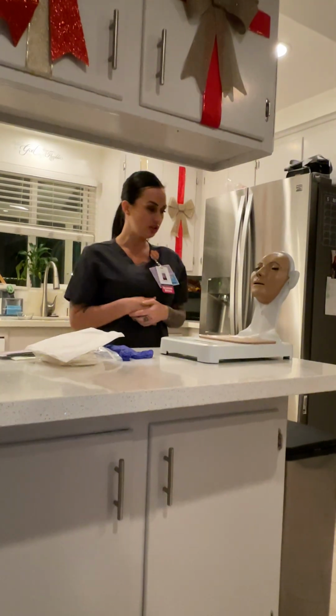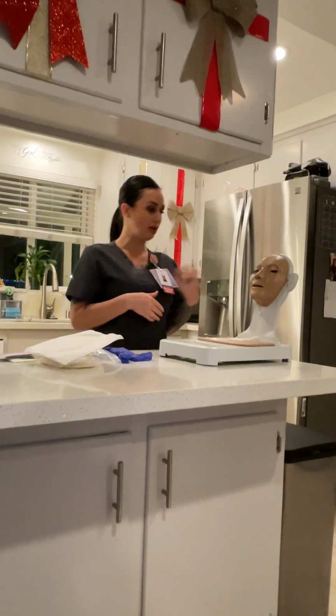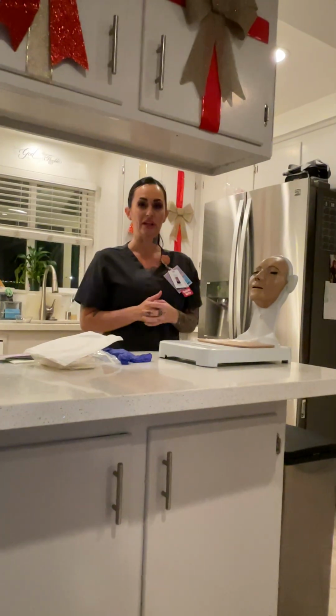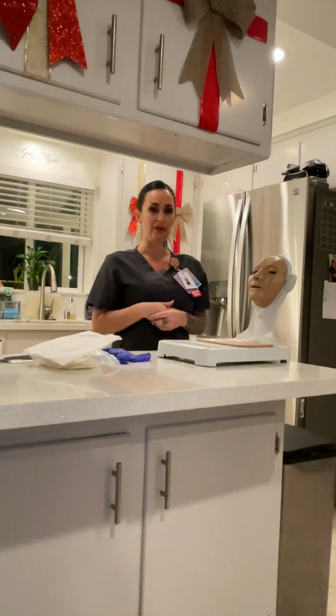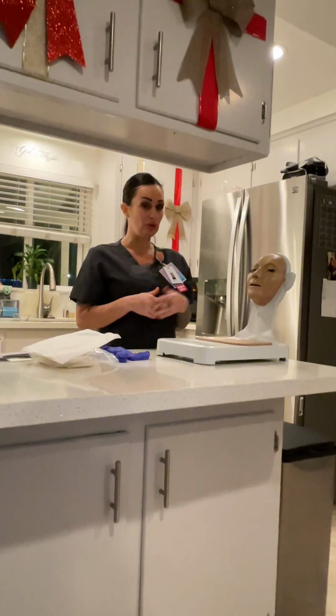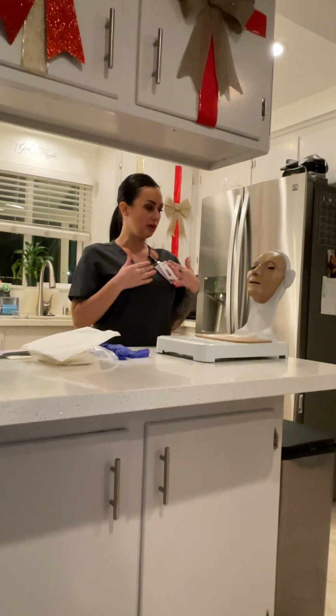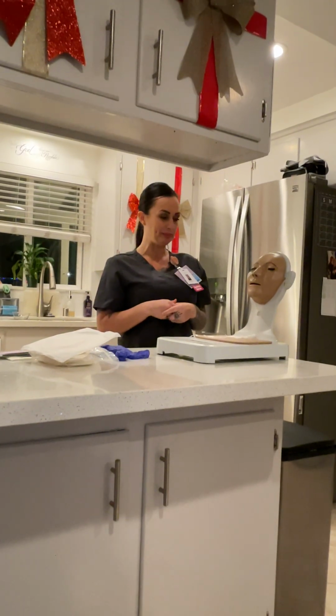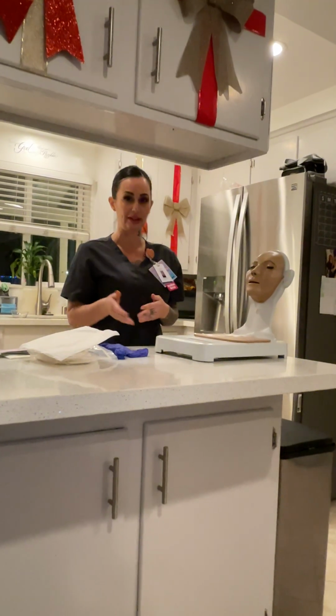Hi, my name is Tasha. I'm going to be your nurse today. Can you tell me your first and last name? Okay, and your date of birth. All right, perfect. So the patient has verified the two identifiers. All right, Mrs. Smith, I am going to let you know that we're going to be doing your sterile dressing change today for your central line. Is that okay? Okay, so she gave me her consent.